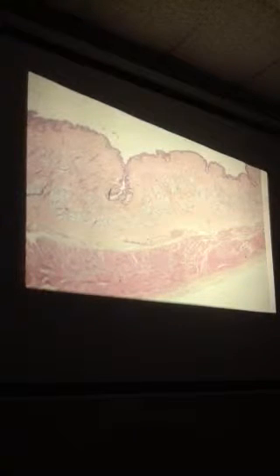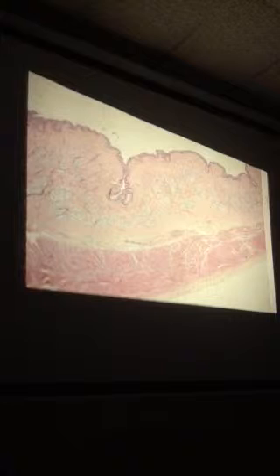So those are your four consistent layers. I'll only ask you them in the esophagus. The other compartments, you have other things to focus on. The last step is to get really magnified on that first layer of the mucosa, sort of a darker blue to reddish layer. So magnify this another 100 times, and you see this.